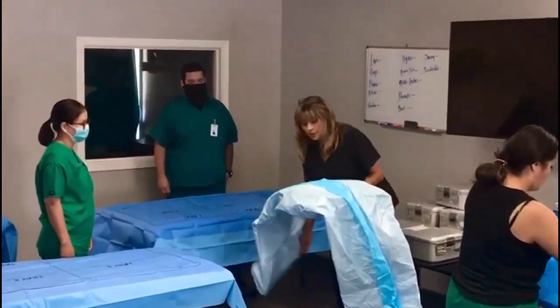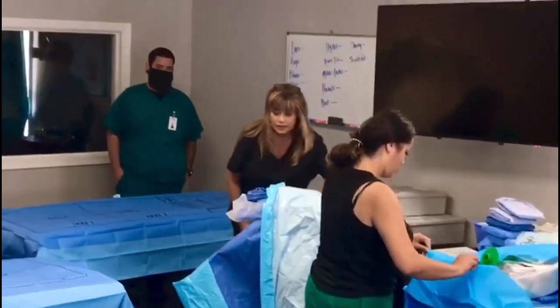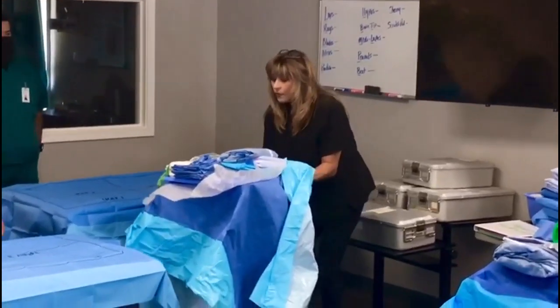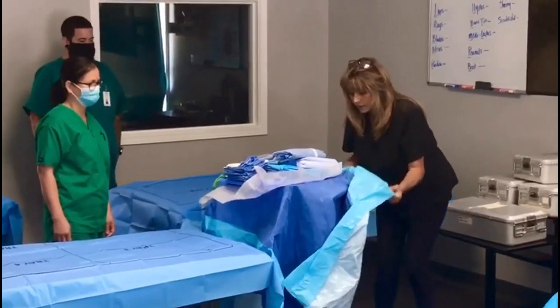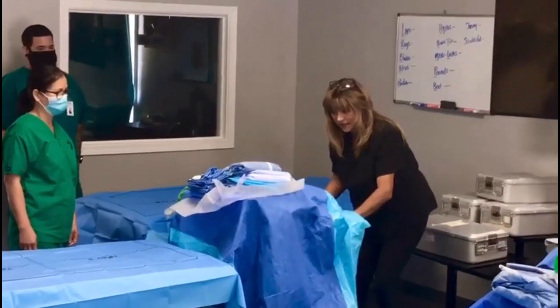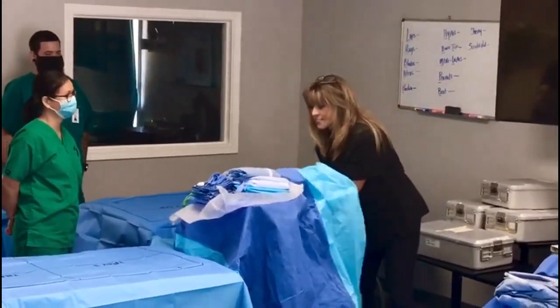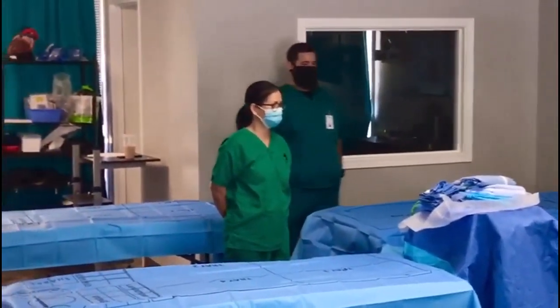We're just going to spread it open. I'm going to move around to make sure I'm only grabbing just the areas that I need to grab. I'm pulling it down and I'm going to pull that right next to my table — I want everything kind of close to me. Sometimes your things slide in the real world, and you see how I'm just maintaining that. It's going to slide. If they hit the ground, they hit the ground, everybody.